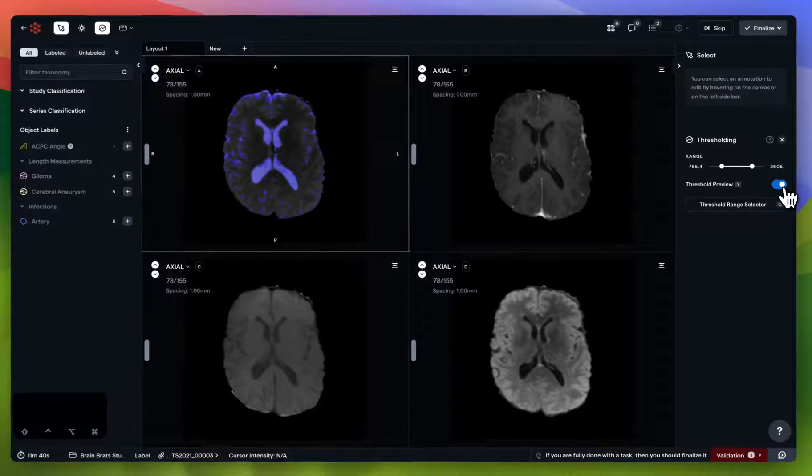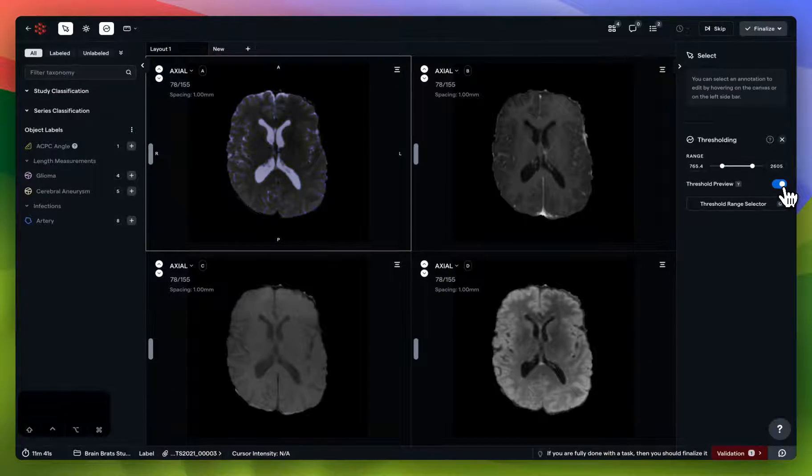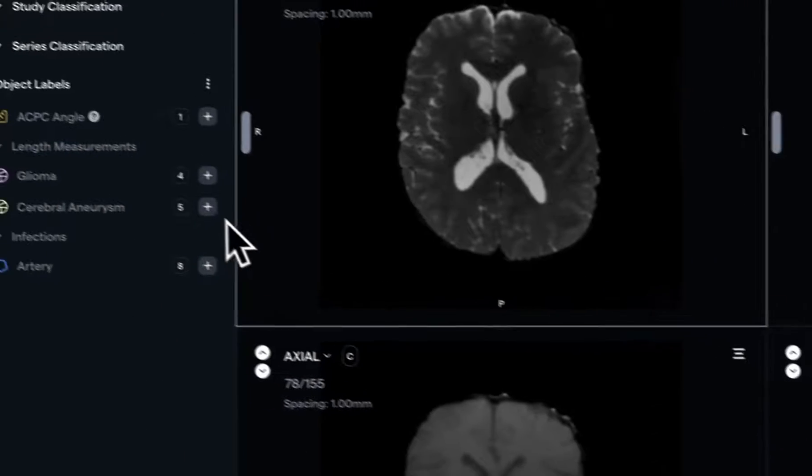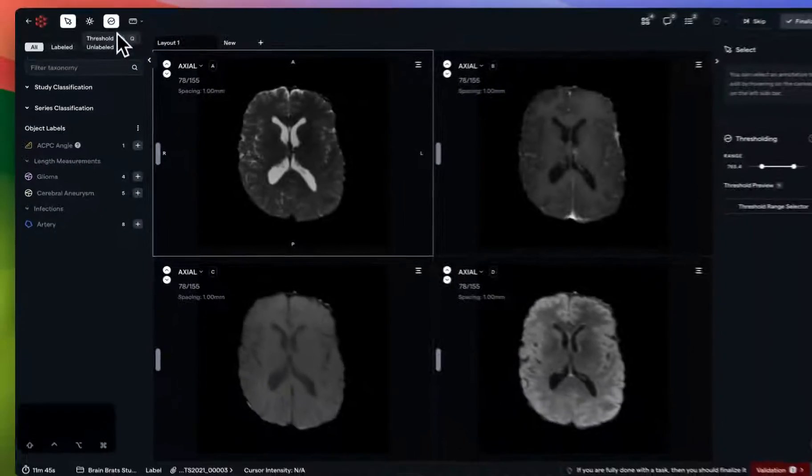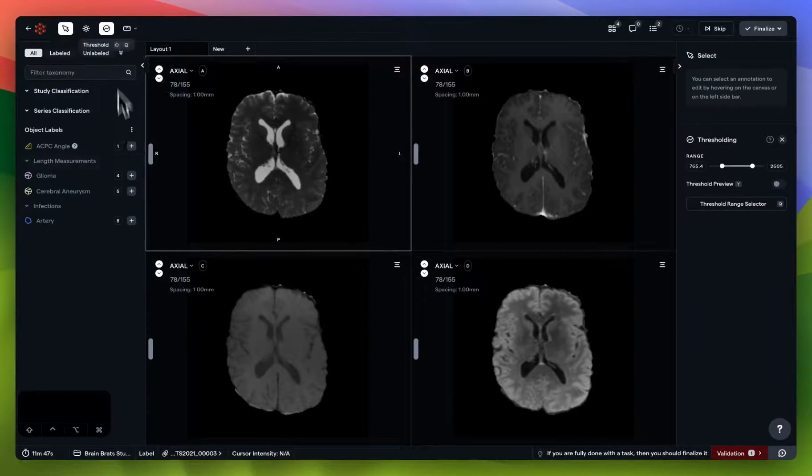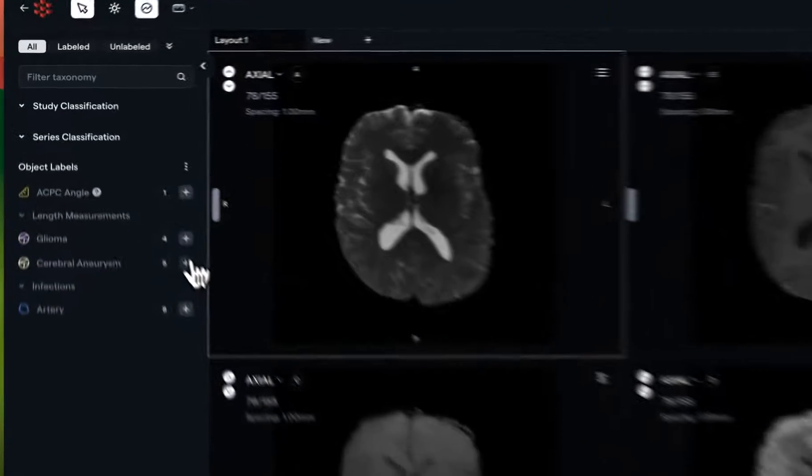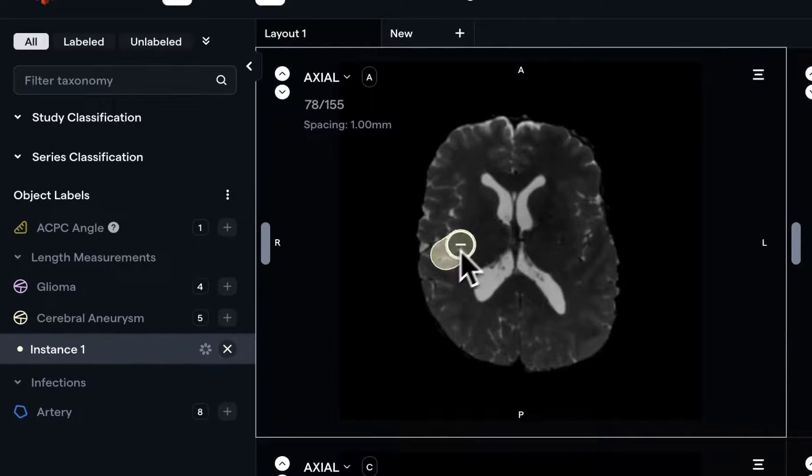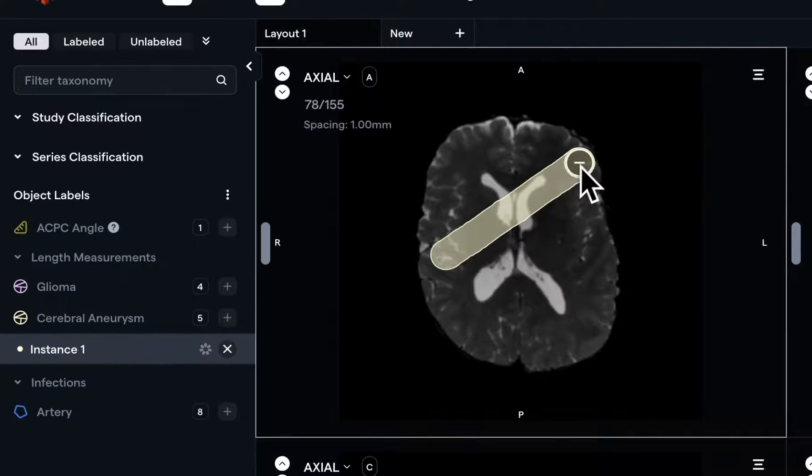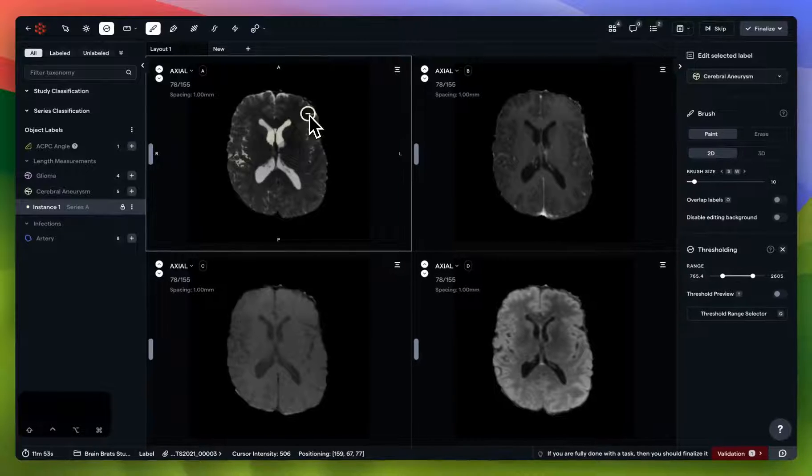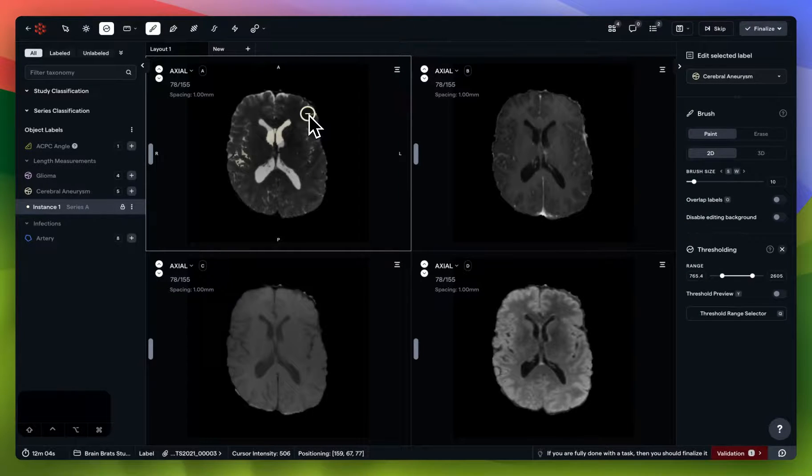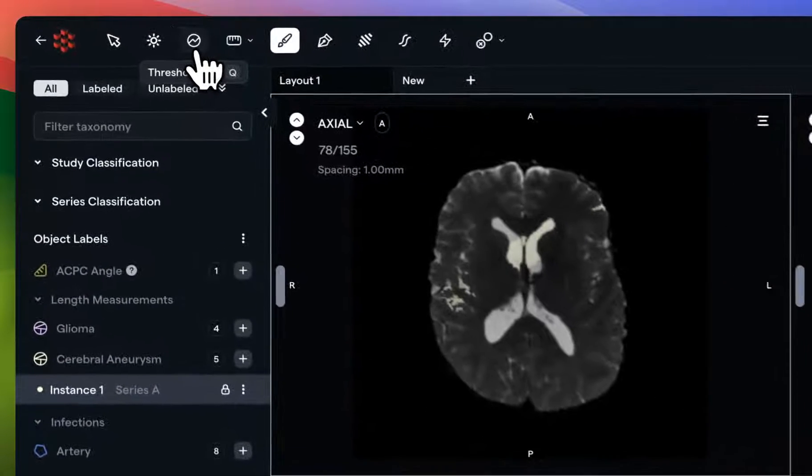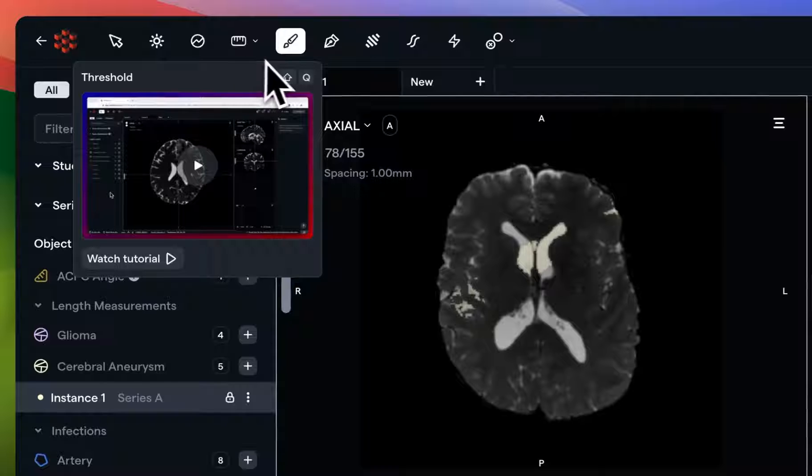Please note that even if you have the thresholding preview disabled, the thresholding panel on the top left is still activated, which means I can only annotate within the strict range defined by that threshold. For now, I'm going to deactivate my thresholding panel so I can continue with the demo.